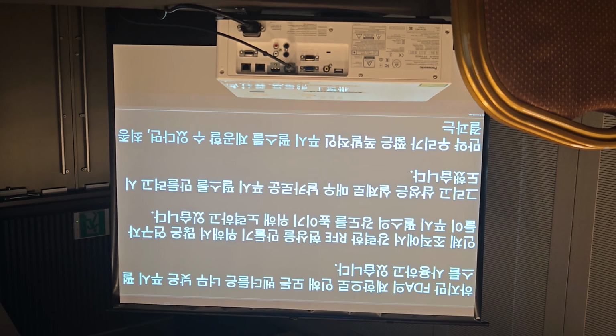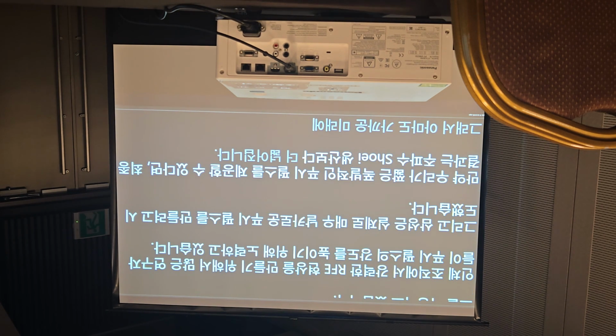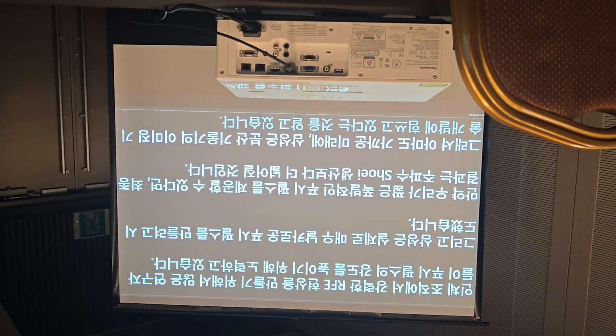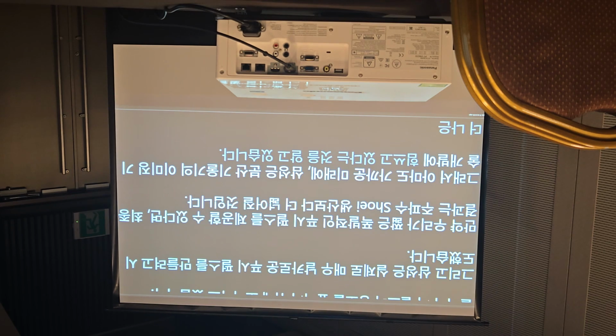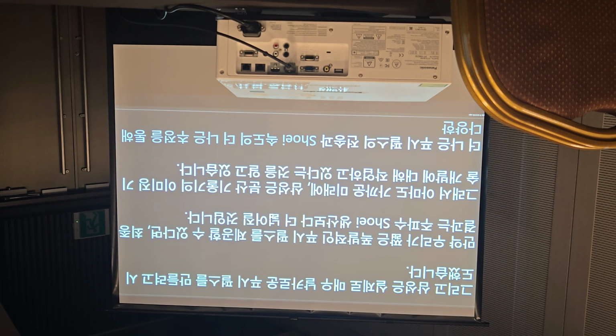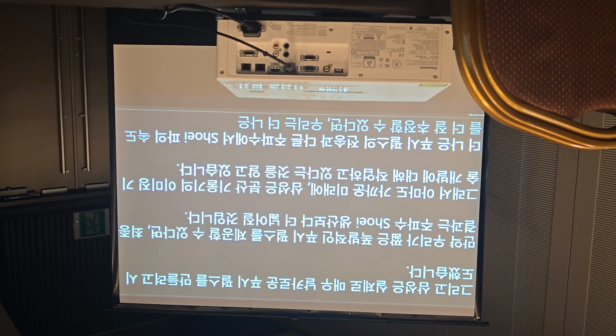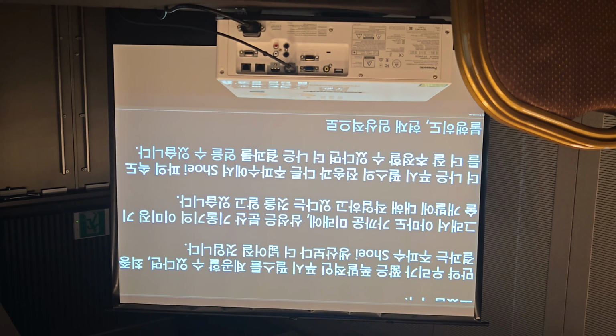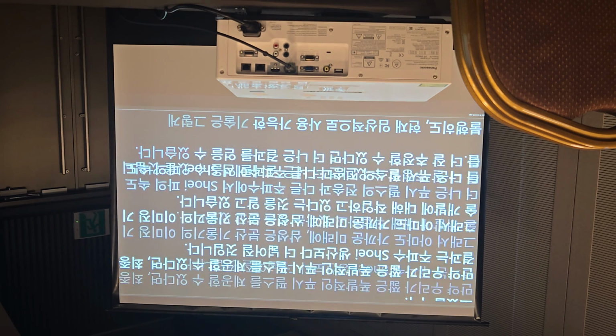frequency shear wave production. So maybe I expect in the near future, I know Samsung is working on development of dispersion slope imaging techniques with better transmission of the push pulse and better estimation of shear wave velocity on different frequency shear waves. We can have a better result. Unfortunately, currently clinically available techniques are not so reliable based on my experience.